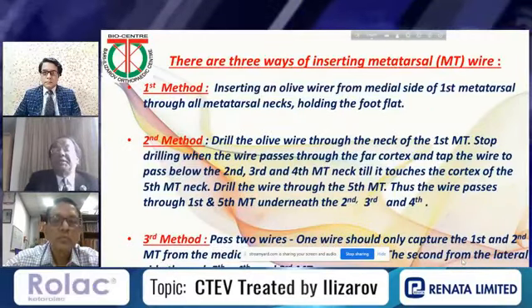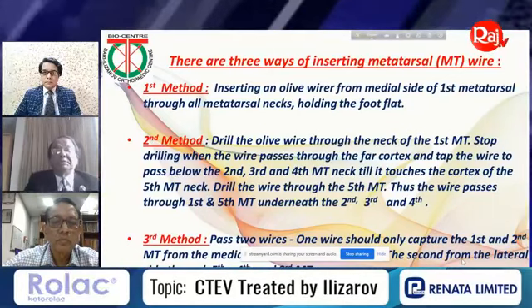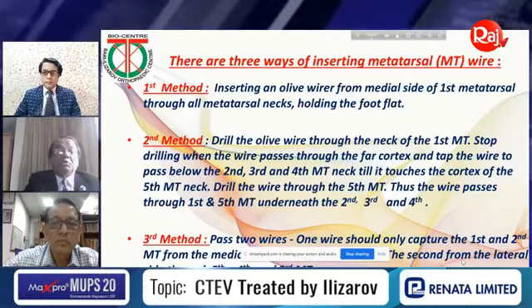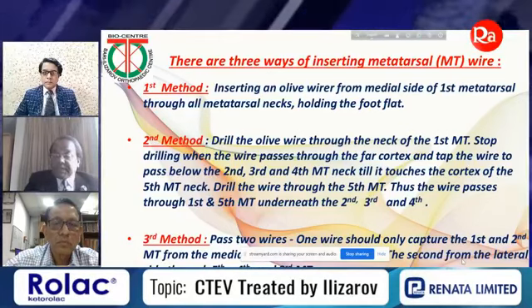Three ways of inserting metatarsal wires. You can see here, first method, inserting an olive wire from the medial side to the first metatarsal through all metatarsal necks, holding the foot flat.